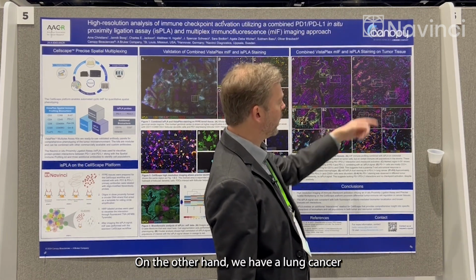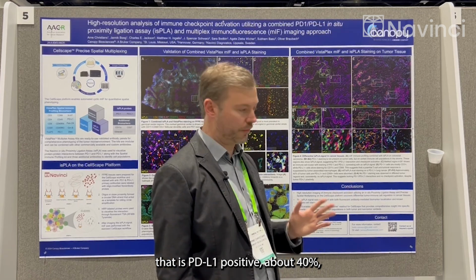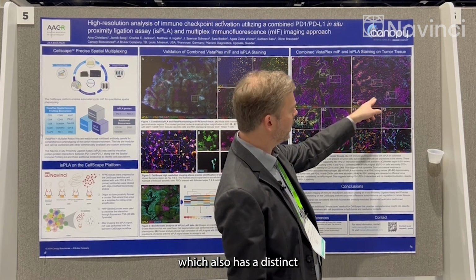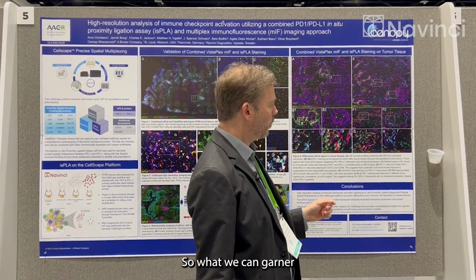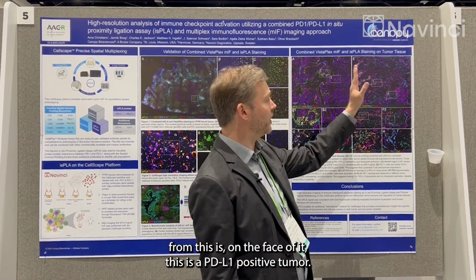On the other hand, we have a lung cancer that is PD-L1 positive, about 40%, so a pretty high score, which also has a distinct presence of T cells and macrophages as well, but there was no PLA signal present anywhere on the tissue, basically.